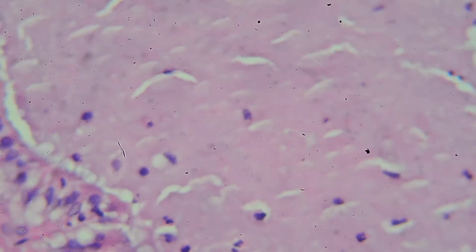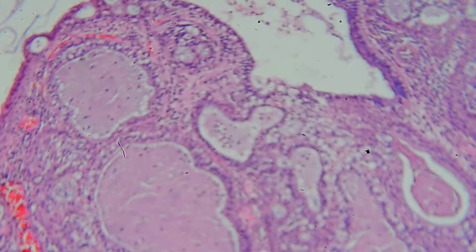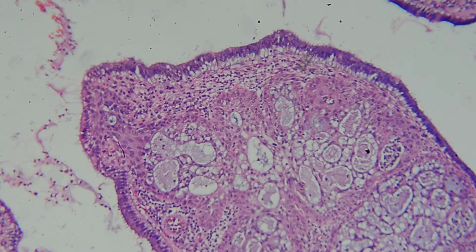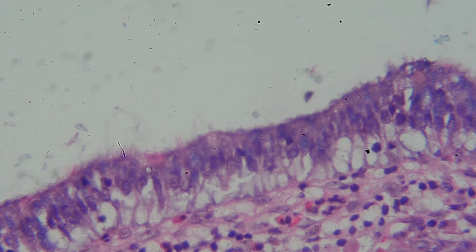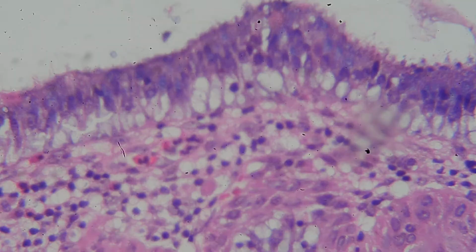So is that abnormal when they secrete mucin? They normally do. This is abnormal also, right? Pathologic? Yeah, endocervical polyp is abnormal, but mostly it's benign. So when you look closer, at higher power, you can see just the lining, simple columnar, mucin secreting, arising from the endocervical epithelium.